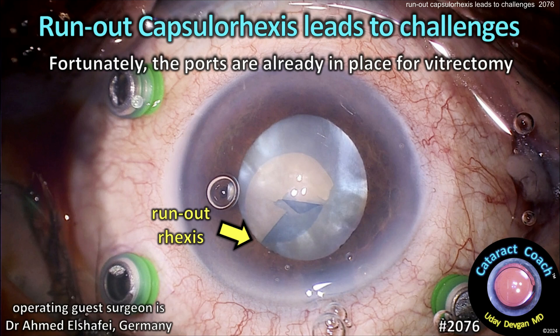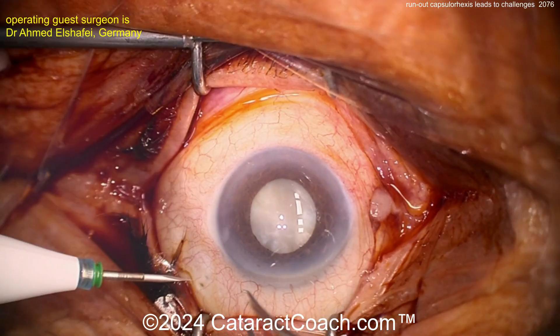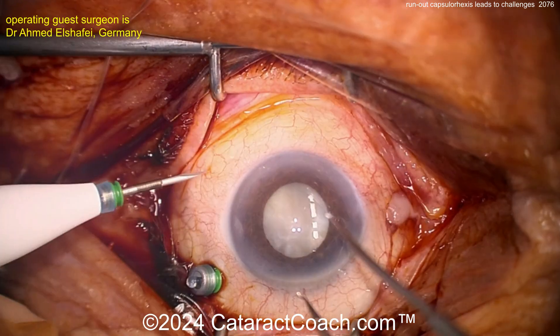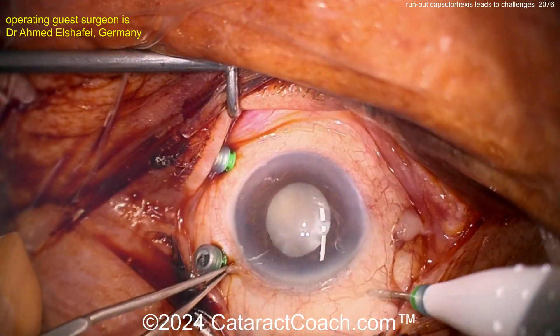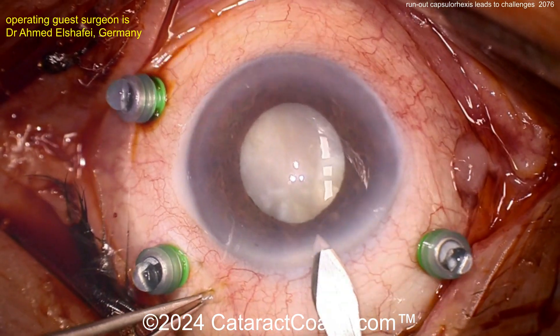cataractcoach.com. The rexis runs out on this intumescent cataract case, leading to challenges. Fortunately, the ports are already in place for the vitrectomy. It's a tough situation — the patient is on multiple pillows and blankets just to get into position for surgery. The case has been prepped nicely and the ports are going in for vitrectomy. Absolutely white cataract here.